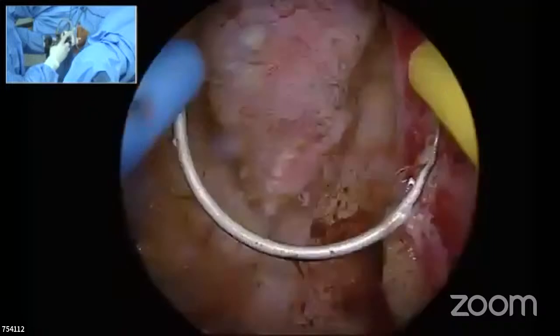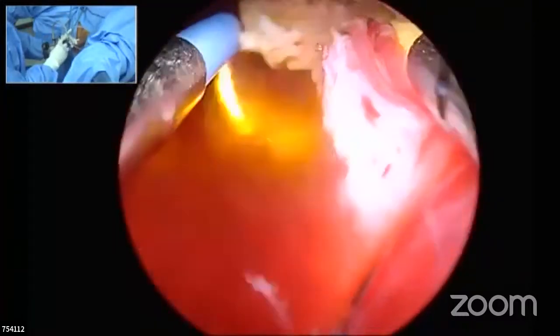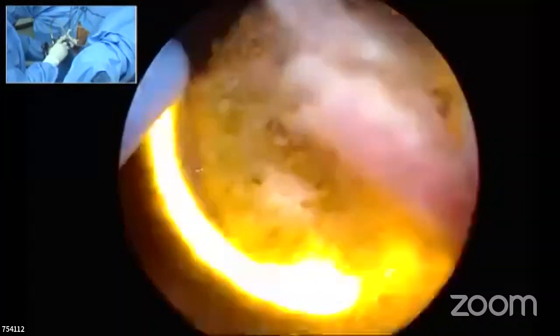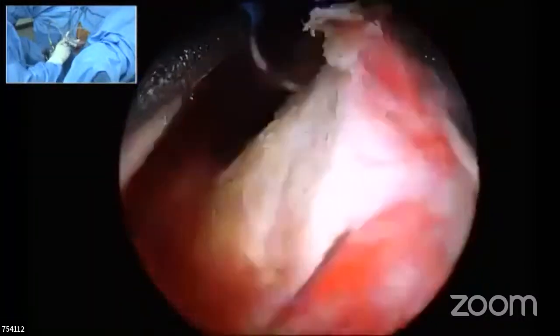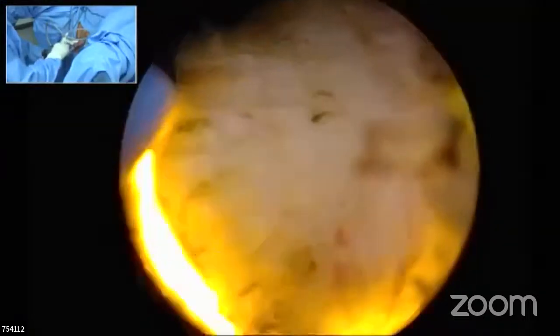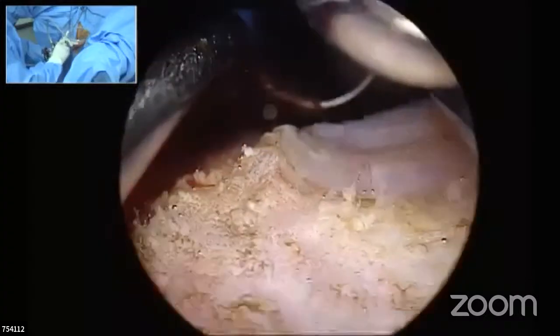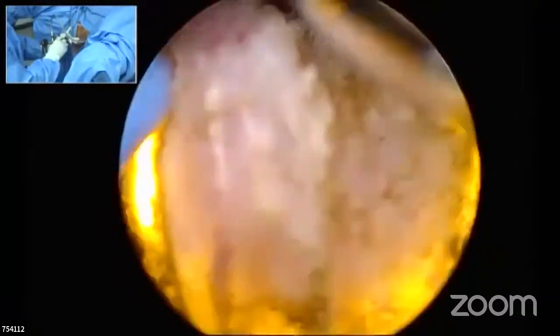So Barnes procedure moves from floor towards the lateral aspect. That's a Barnes. So you have done something in the floor. You do one and start going up towards the top. Again, you come from top and come to the bottom. This is a typical Barnes way of doing it, but it starts from the floor and goes to the lateral aspect.